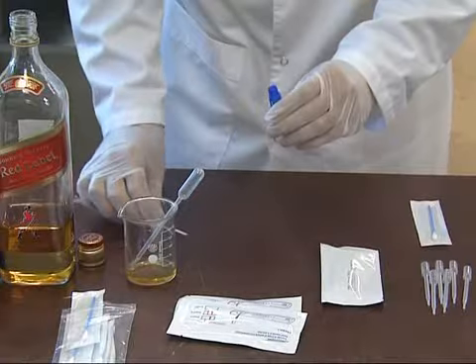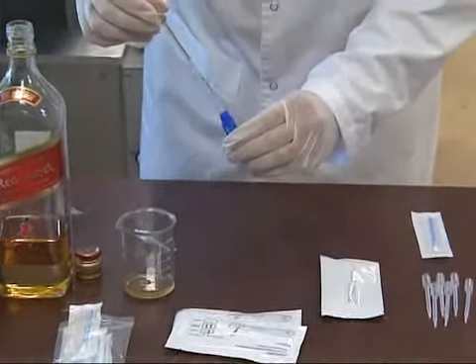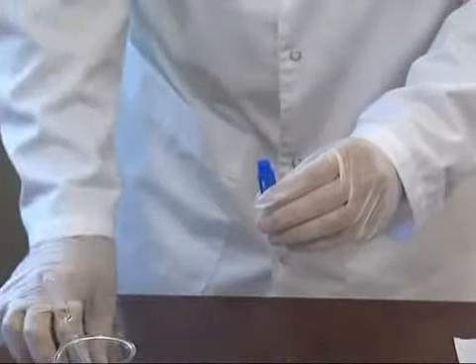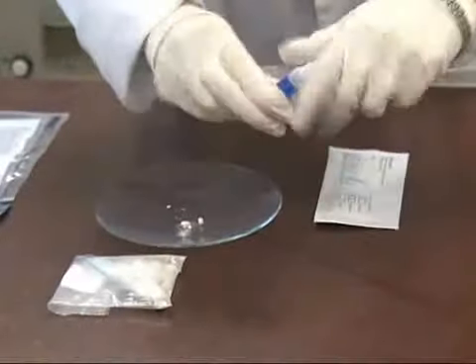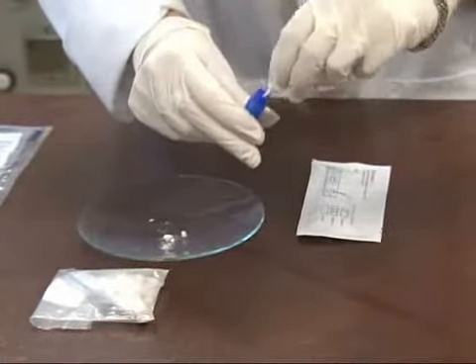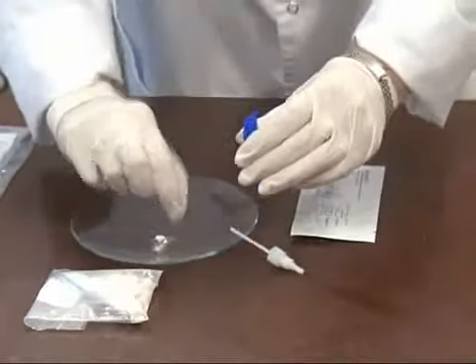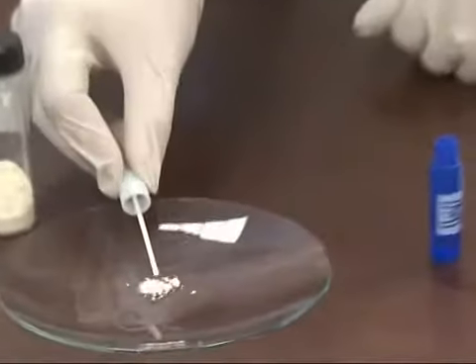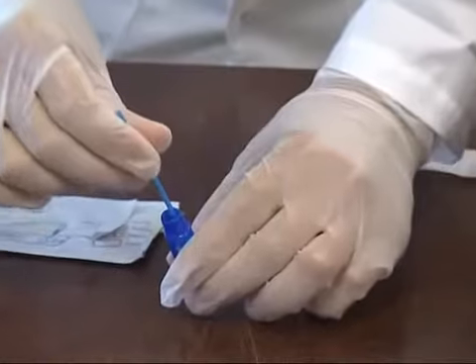M.M.C. forensic narcotic tests. The M.M.C. forensic tests are especially developed for an extra confirmation in inconclusive cases or in diluted or impregnated substances such as a controlled substance in beverages or in jeans, etc. Unscrew the white closure of the M.M.C. special buffer solution container. Place a small part of the solid or tablet in the container of the M.M.C. special buffer solution. Note, cannabis, THC, and tablets or chunks: leave the bottle for 4 to 5 minutes before testing.